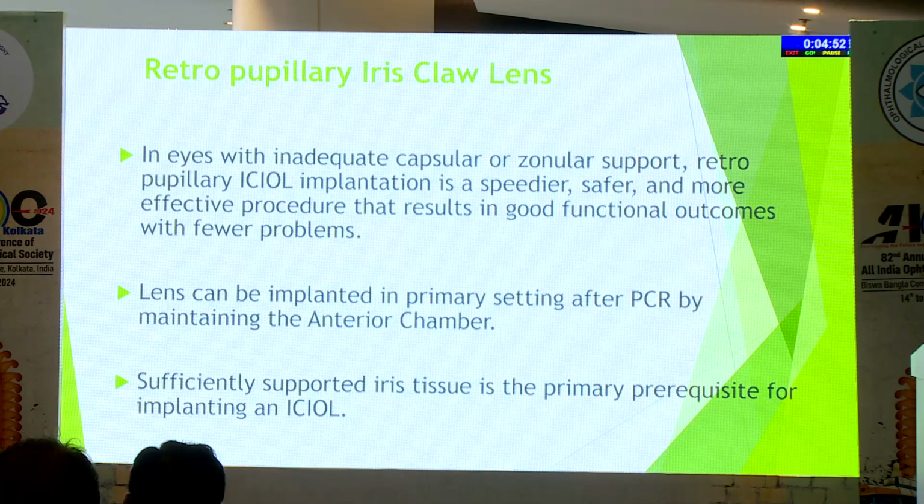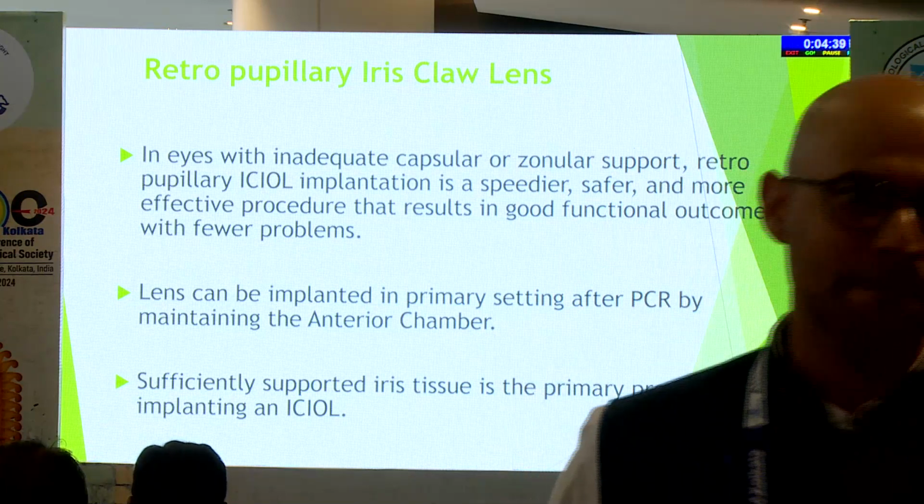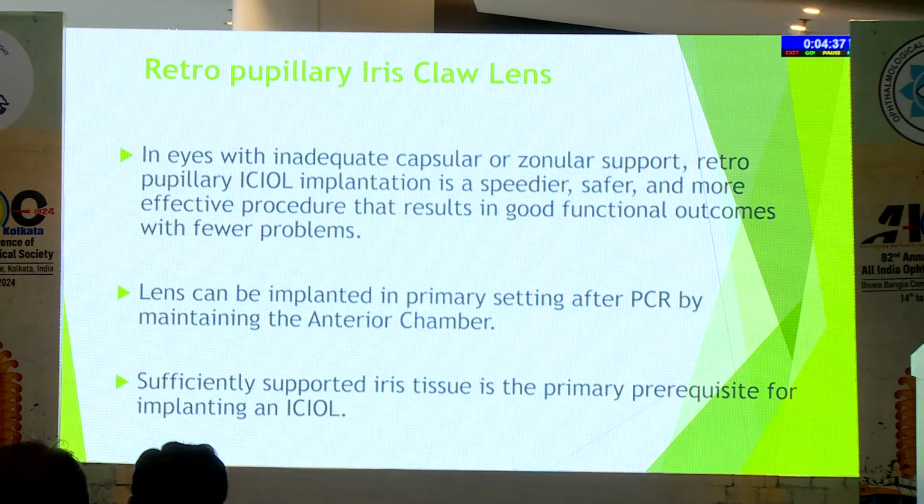While managing your nucleus drop with the iris claw lens, as already mentioned by our prior speaker, it is very safe, very speedy, very convenient and easy. Anyone can do it; even the residents are doing it very well. With a few tips and guidance, you can start with the iris claw lenses without any special training. There is a very short learning curve.